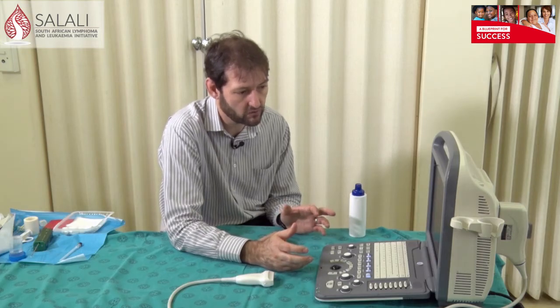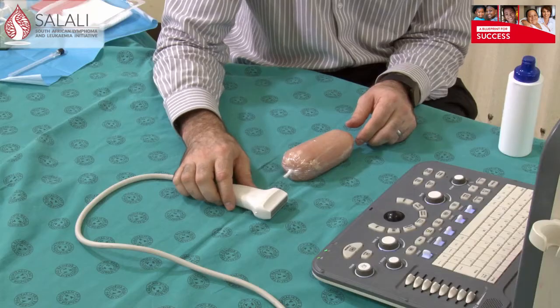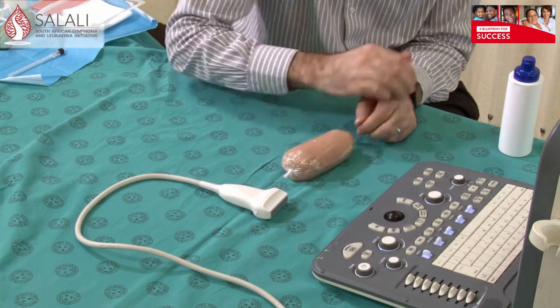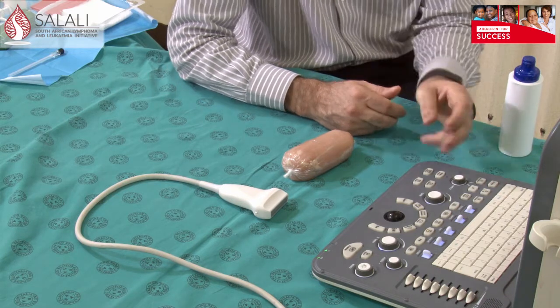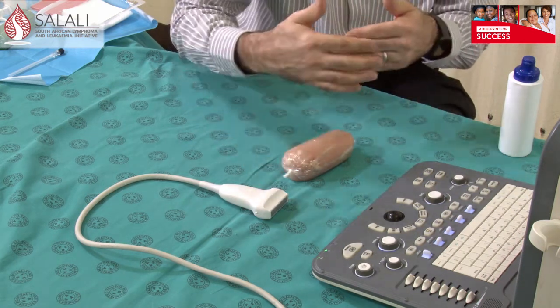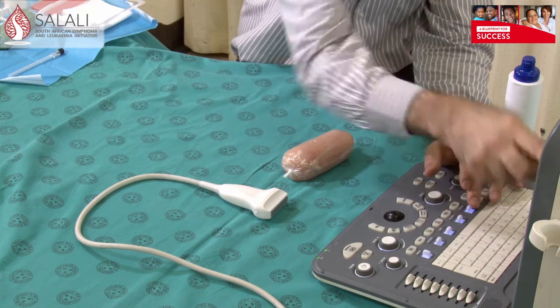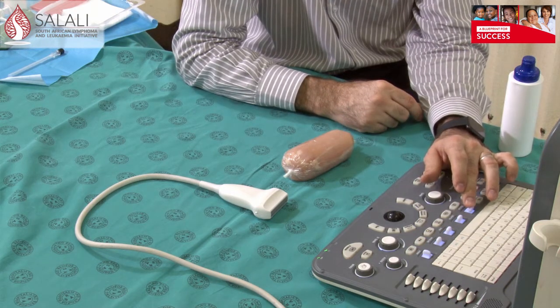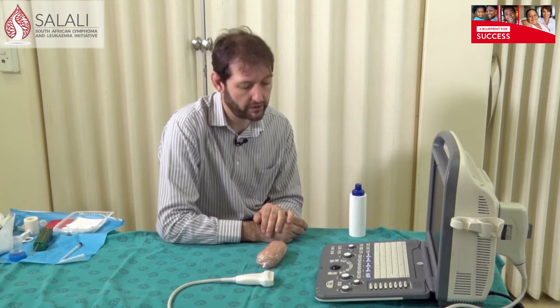You can change settings if you're not happy with the image quality. You really only need to know a couple of buttons on your machine. One is your gain, to improve image quality if needed — sometimes the standard setting is all you need. There's a depth button to set how deep you're scanning, bringing the image closer or further in the field. This machine also has a focus — that little red button on the side — which you can move up and down to put it in line with the lesion you want to biopsy. Those are basically the only buttons I use.